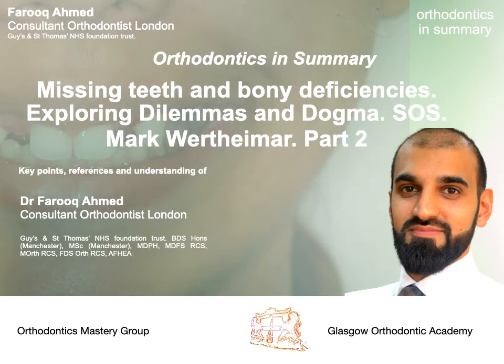There are consequences further around the arch though. If we're going to disguise the first premolar or the bicuspid as a canine tooth, there has to be some compensation for the gingival position. This is achieved again through bracket positioning. This time the bracket is positioned more incisal or more inferior. This intrudes the first premolar, and that allows the gingiva to go more superior, creating that step between the lateral incisor, or the canine as it now is, and that first premolar disguised as a canine.